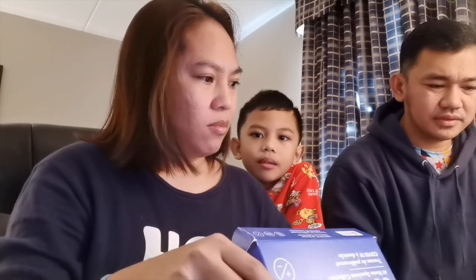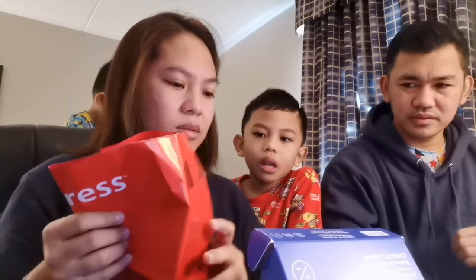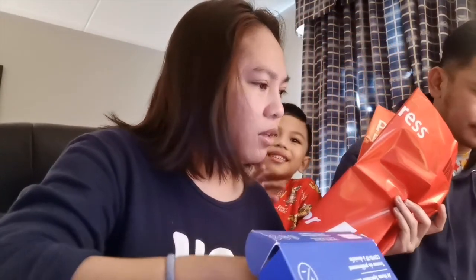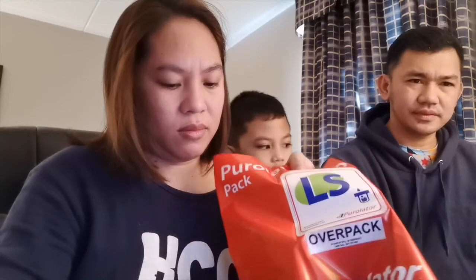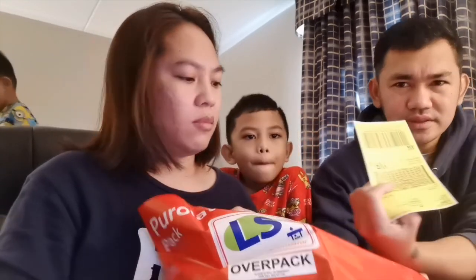Here's your bag. And then you should have a little clear circular sticker to seal it. What is that sticker? This one. Yes. After that we'll put it in the bag right away.